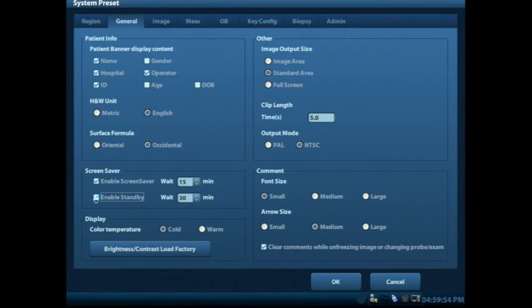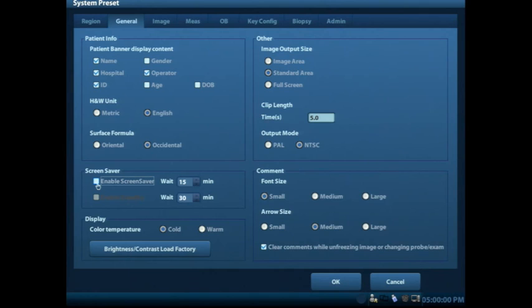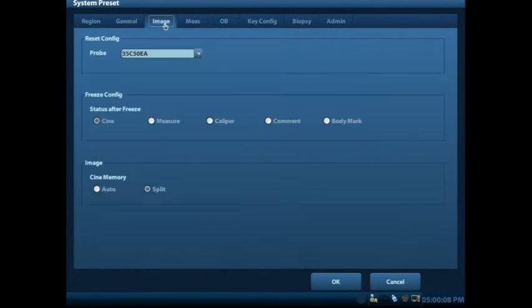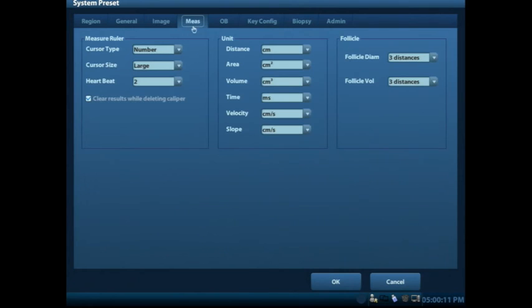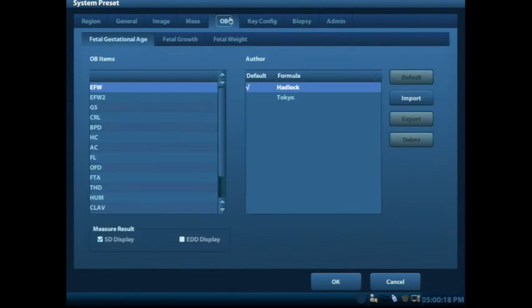Some places prefer to have that standby and screen saver, other places may not like to have that. So we'll go ahead and deselect those. And we'll also look at font size as well as arrow size, but you'll see these tabs across the top of the screen that allow you just to look at some of the imaging parameters and different things in the setup in terms of your measurement units. And it's worth exploring and taking a peek at these.